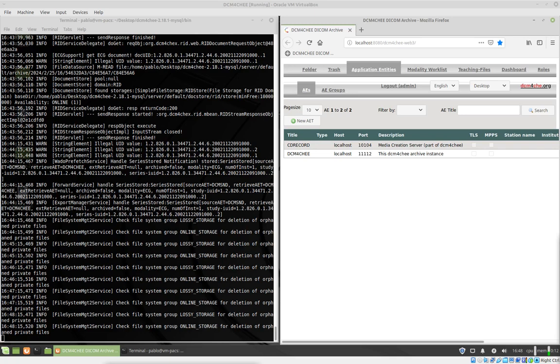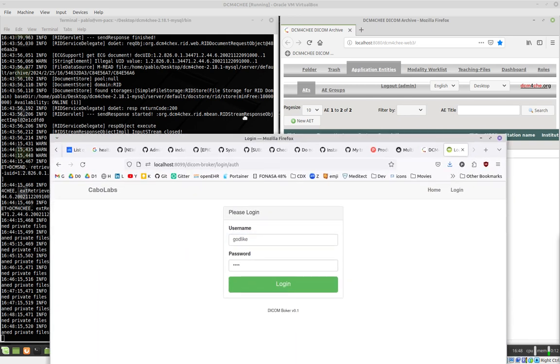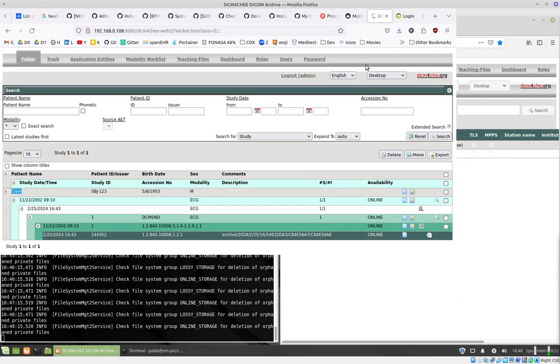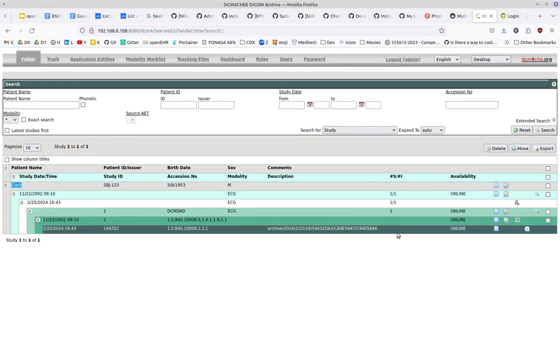Here I'm just working with DICOM and the DCM4Che PACS and testing some software for a training session. So I found maybe recording this might be fun. I have a virtual machine with an old version of DCM4Che that works really good.